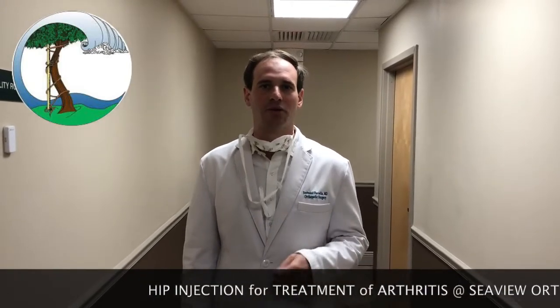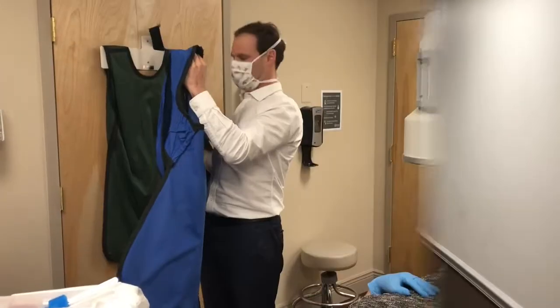This video is going to be of me giving an injection for the hip. I treat a lot of arthritis in my office and injections are a really nice alternative to surgery. Oftentimes they can delay or even prevent the need for a joint replacement. So let's go and see how we give a hip injection.